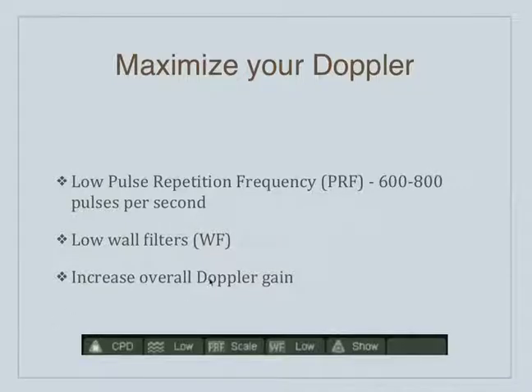The wall filters are another thing that helps — if you put it on a low wall filter setting, that will also make the machine more sensitive. You can also turn up the color gain, like you can turn up the grayscale gain. When you're working with the Doppler settings, the gain changes to color gain. What used to be grayscale gain is simply color gain on the machine — the button just changes its functionality to color.